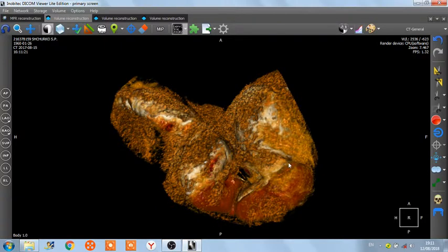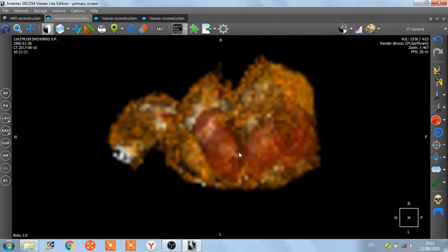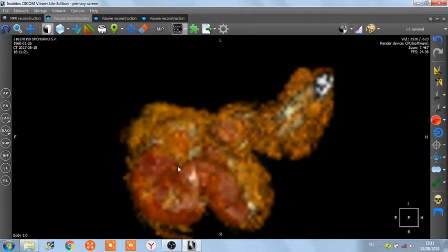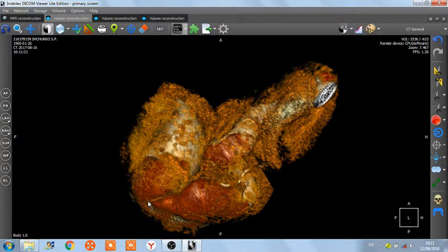And here. So with different frequencies we can clearly see what happens there, where the main things, arteries, are going in here, here, and here too. There. They hardly squeeze inside there. So that's it.